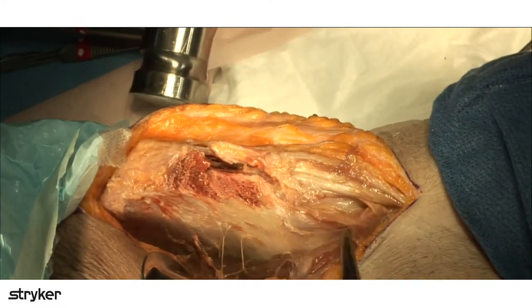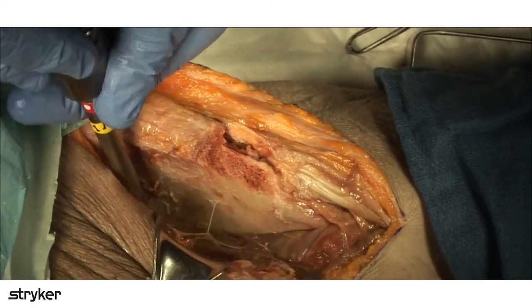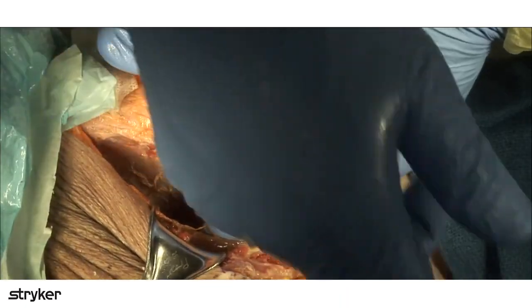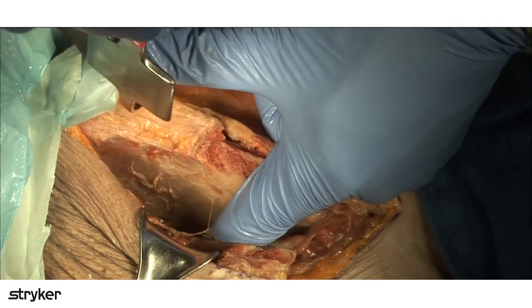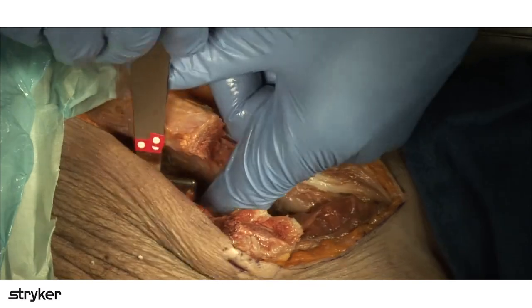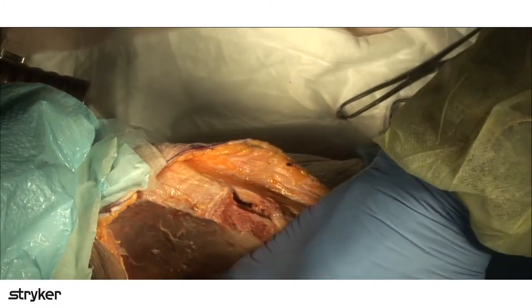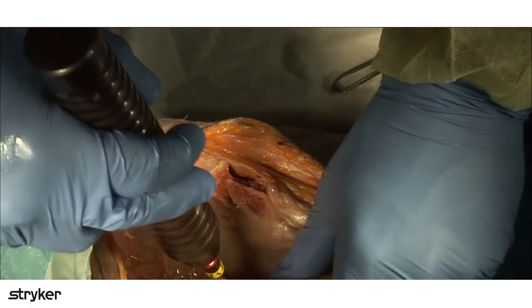But here you can see, now all of a sudden, your lateral window opens up like crazy. Where's that sharp Homan? I'll slide my sharp Homan down, feel it go over that anterior ridge of the SI joint, and stick it right in the SI joint and bring that over. Then I'll usually put something like a Cobra over the brim here.